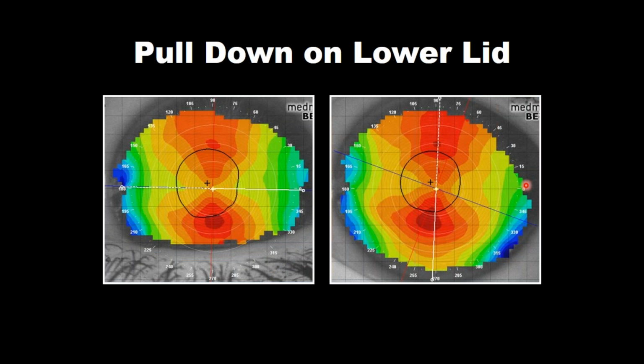Now, as we said, pulling down on the lower lid has its value not only in removing the lower lid from blocking the rings and the eyelash shadows, but of course we have a lacrimal lake at the bottom that could create false shape that isn't actually there. So just simply pulling down on the cheek can be a way we can get a lot more coverage on the eye.